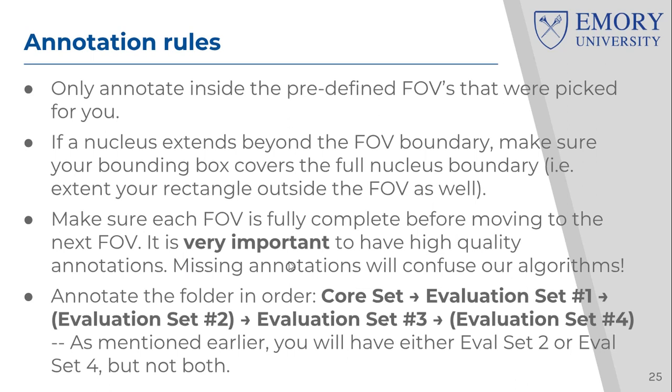Make sure there are no missing annotations. It's very easy to miss nuclei in this schema. Even the computer misses a lot of nuclei. So please make sure that you annotate every single nucleus that you see. If the nucleus is vague, don't leave it. Label it as unlabeled. Okay.